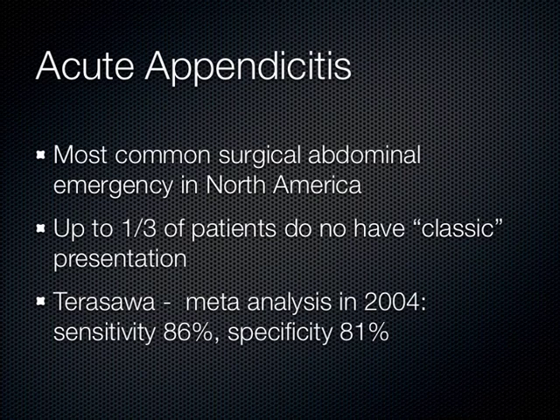And certainly when I have a kid in my ER, 10, 12, 14 years old, I really try to avoid getting a CAT scan on them, though sometimes I have to get it because the benefit outweighs the risk. Now, if we could get good with ultrasound, though, and see a true appendicitis on ultrasound, we could avoid the need for a CT scan, especially in a younger patient. The average age of somebody who gets appendicitis is 27 years old.